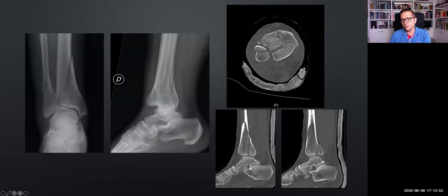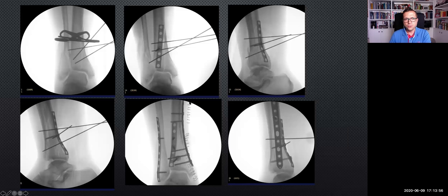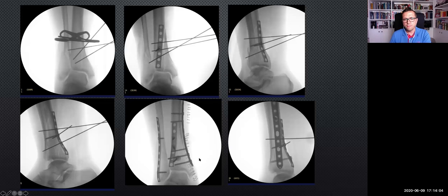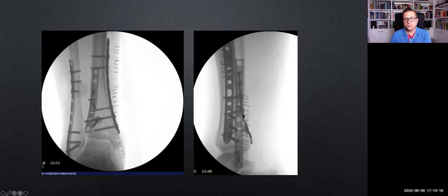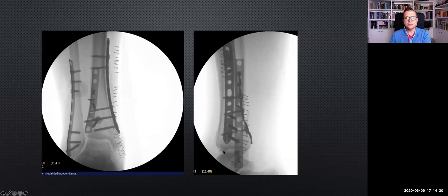These are the concepts we follow nowadays. First, to fix the posterior fragment — you see the posterolateral approach with temporary fixation using K-wires — and then the anterolateral approach with an anterolateral plate. Finally, the fibula can be fixed percutaneously, as in this case with a plate. This is the final construct with a very nice restoration of the joint line.